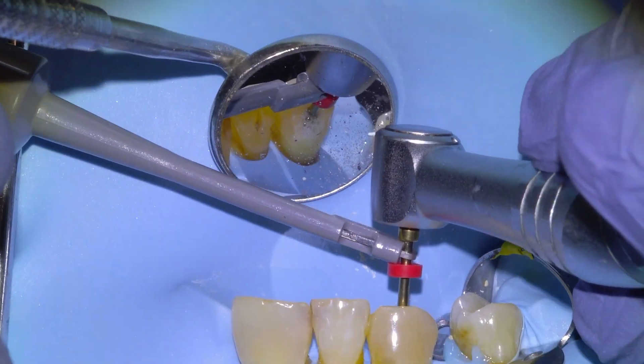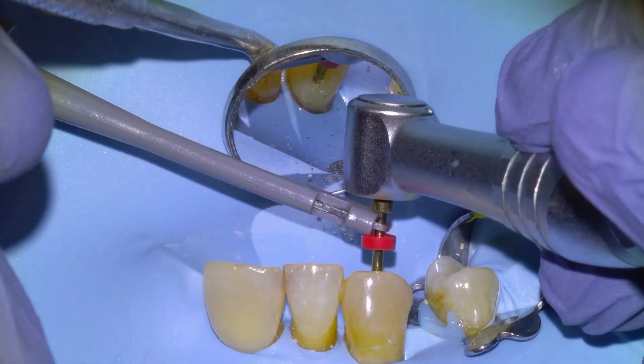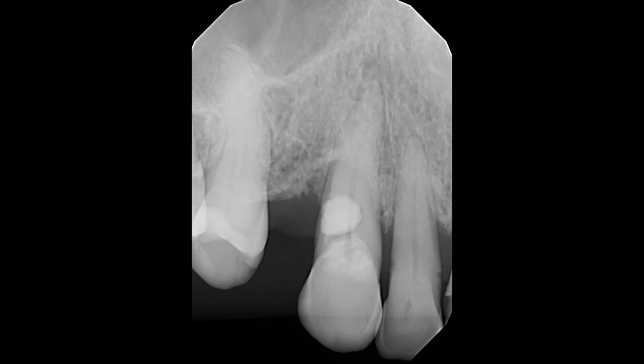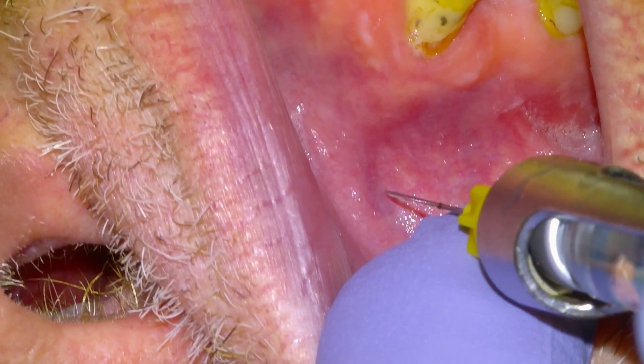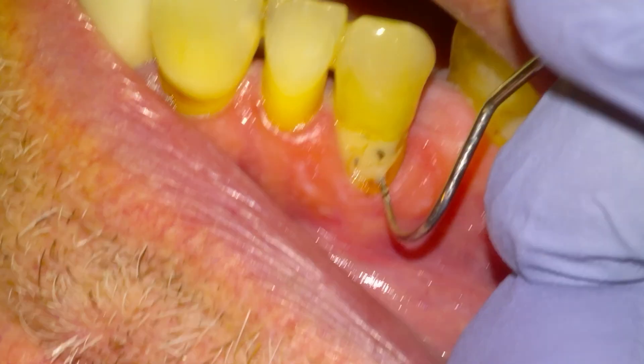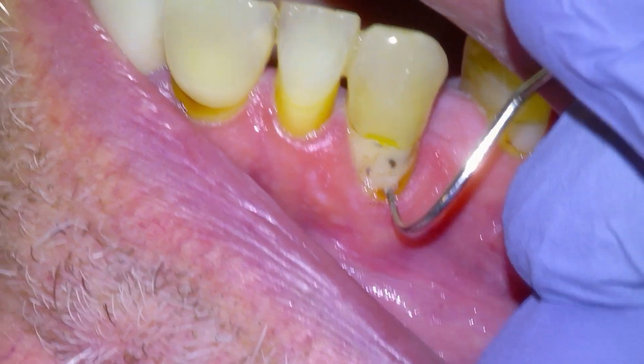Hi everyone. In this one we're going to be doing a root canal on an infected canine tooth. This is a patient that came in with pain on his canine tooth and the x-ray shows a dark lesion at the end of the root tip indicating an infection. This tooth also had quite a bit of gum disease — you can see the bone loss. We talked about options and the patient wanted to save the tooth, so we're going to begin by freezing with Articaine.